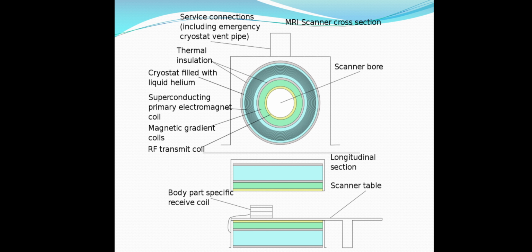This device has the following mechanism in most medical applications: hydrogen nuclei, which consist solely of a proton, that are in tissues, create a signal that is processed to form an image of the body in terms of the density of those nuclei in a specific region. Given that the protons are affected by fields from other atoms to which they are bound, it is possible to separate responses from hydrogen in specific compounds.